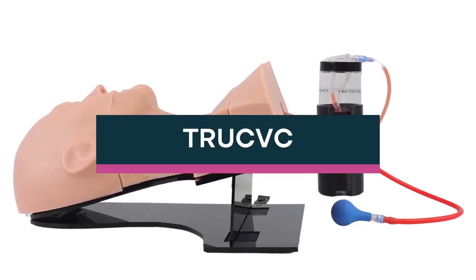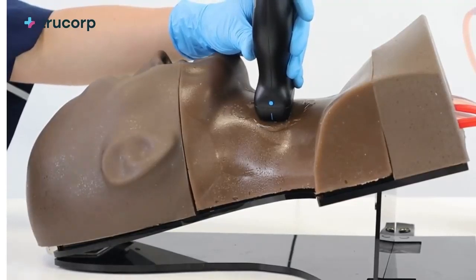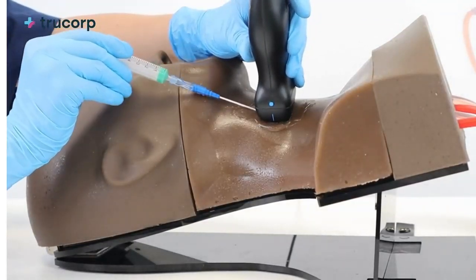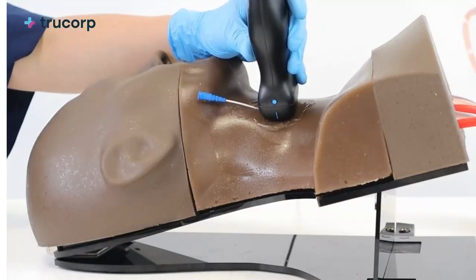Introducing TruCVC — a visually accurate ultrasound guided simulator for realistic training in central venous catheterization and central line insertion. TruCVC provides unmatched realism for developing central line skills in needle insertion, wire manipulation, and catheter placement under live ultrasound guidance.